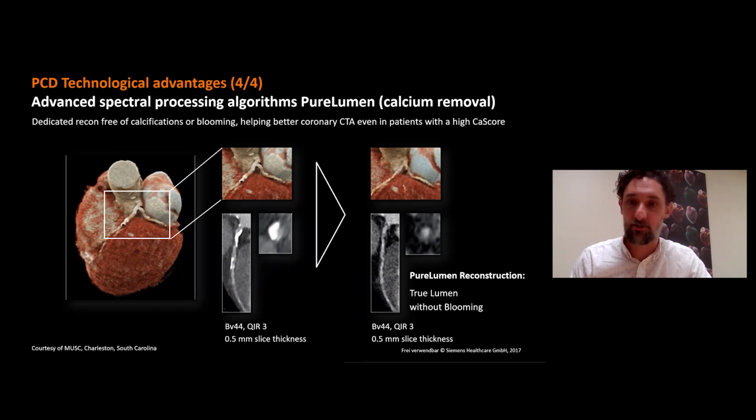Patients with advanced coronary artery disease and a high degree of calcification didn't profit from the advances of non-invasive imaging and had to undergo the current gold standard, catheter-based angiography. So there's a need to provide more information for these people to guide therapy and give cardiologists more space for treatment interventions, and potentially to reduce the burden for the patient to receive the right diagnosis and improve the assessment of their own individual risk.